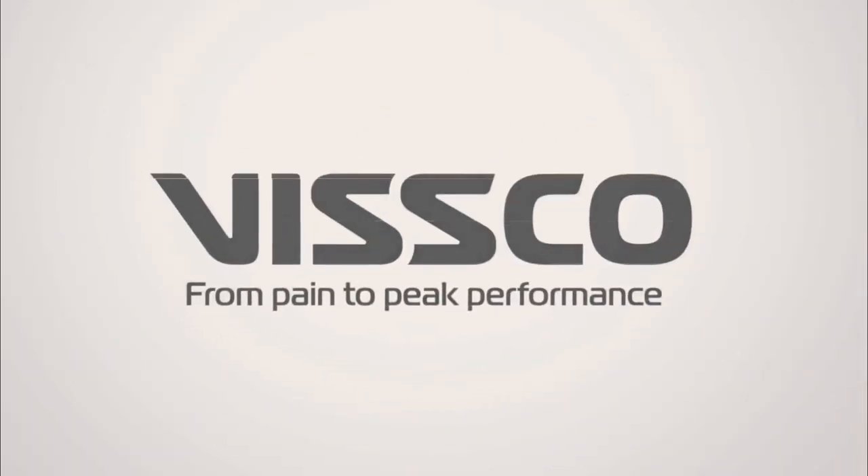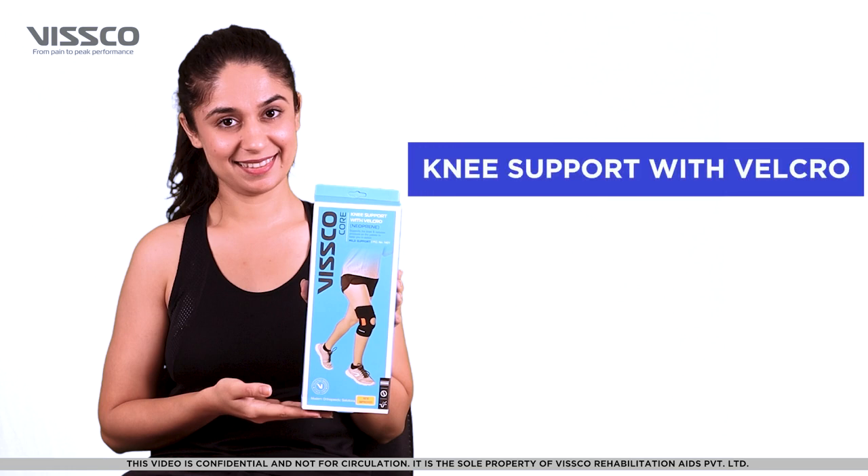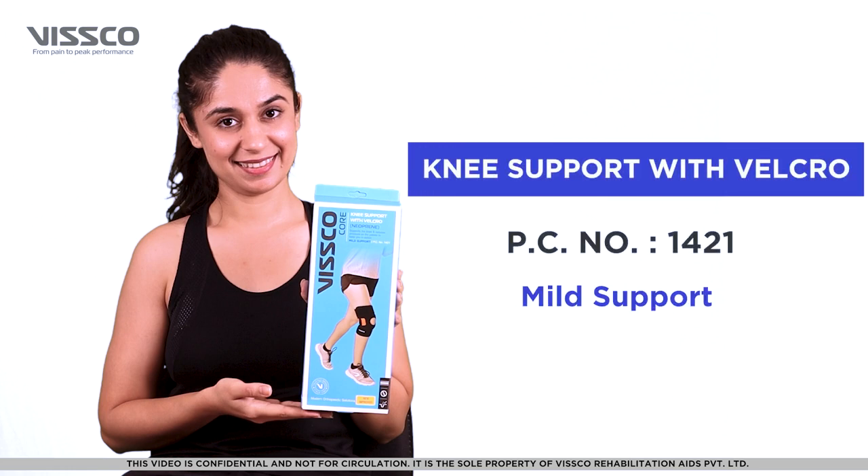Hi there! Greetings from Vissco! Let us now see how to wear the Vissco Neoprene Knee Support with Velcro, Product Code 1421.